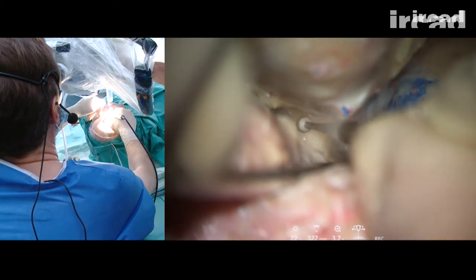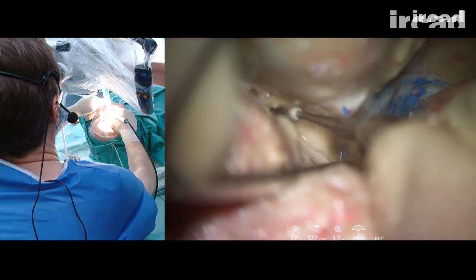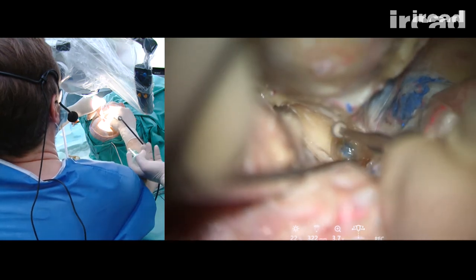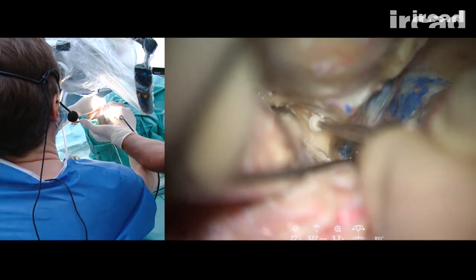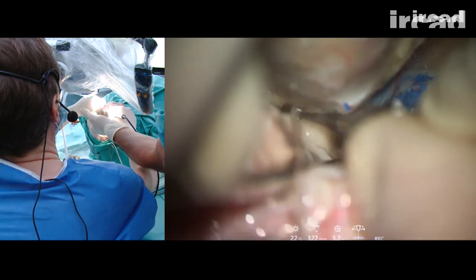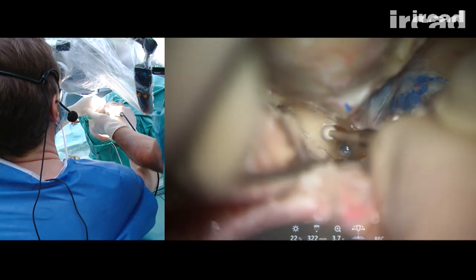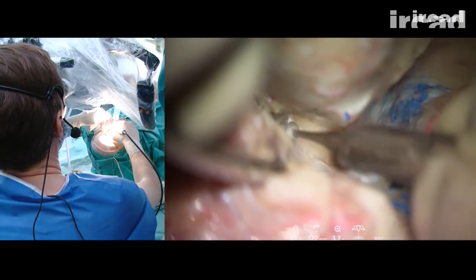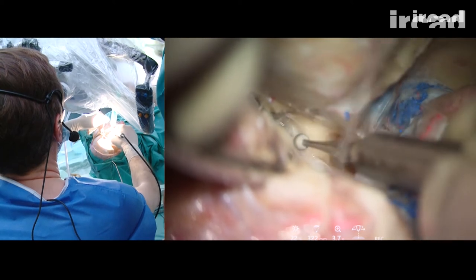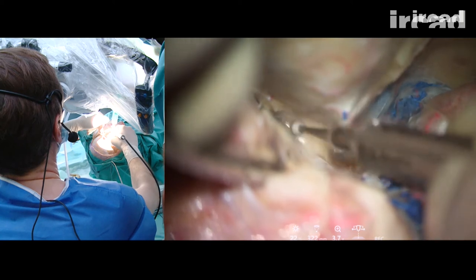When you do that, you need a constant irrigation. One of the biggest dangers for the optic nerve is heat. Every time the bone changes color and becomes yellow, it means that the heat is very high. Under constant irrigation.